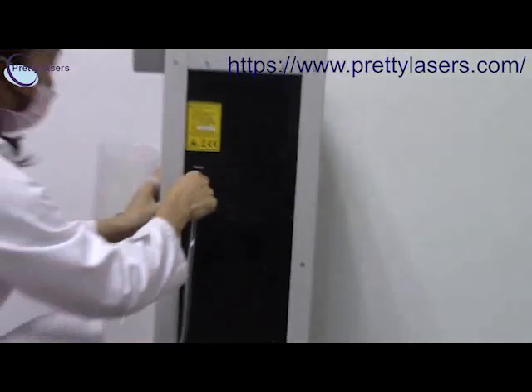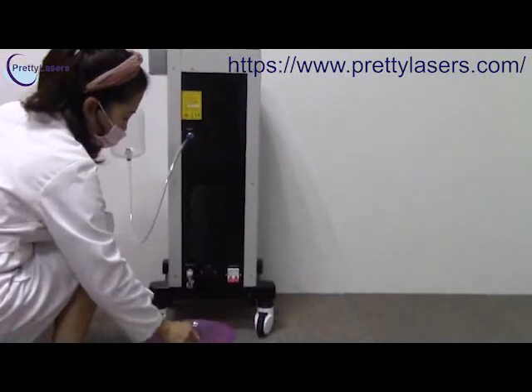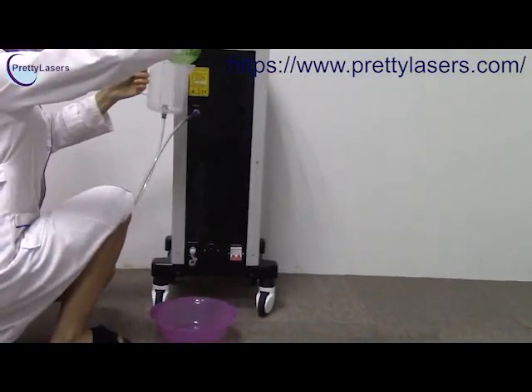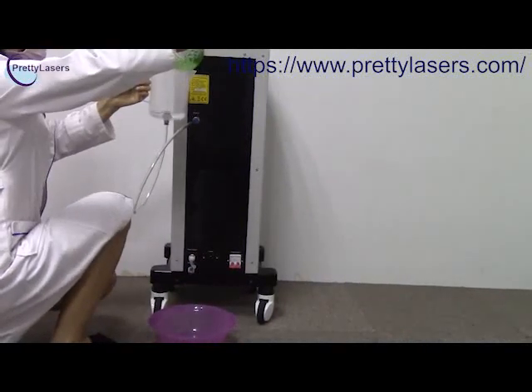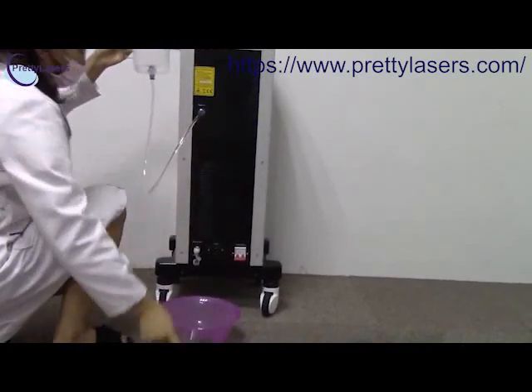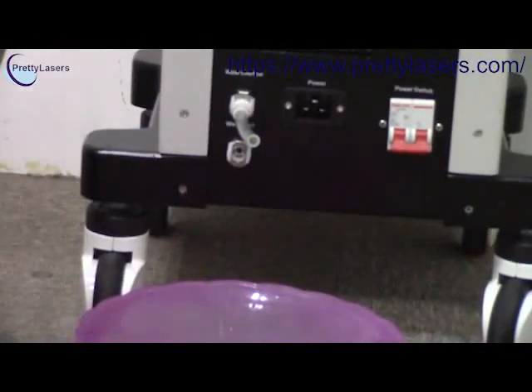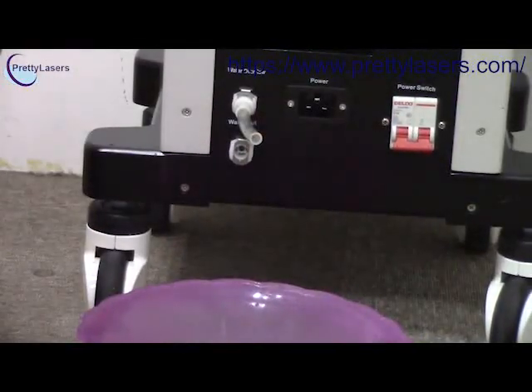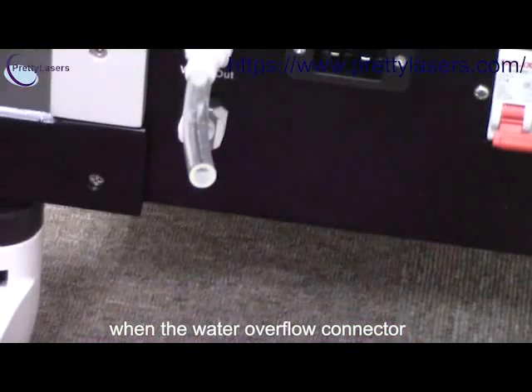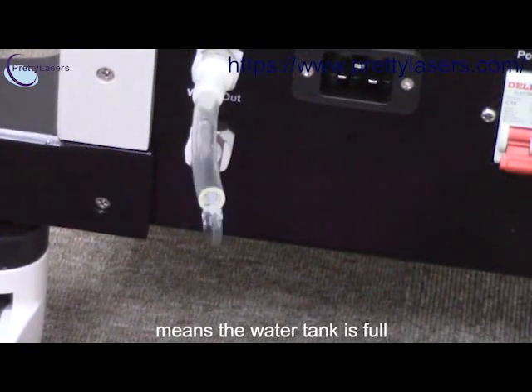Now we insert and then add the water. If the water is full inside, it will come out from the water flow hole. You will see the water is coming out.